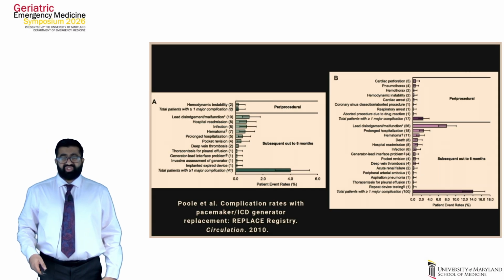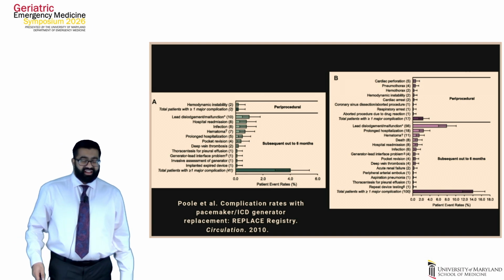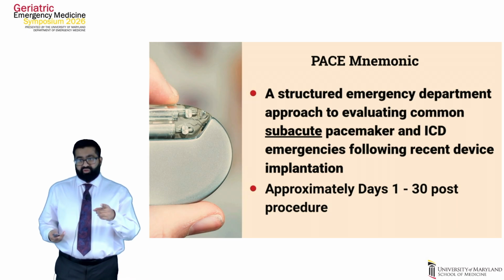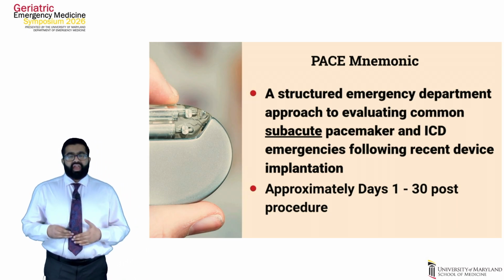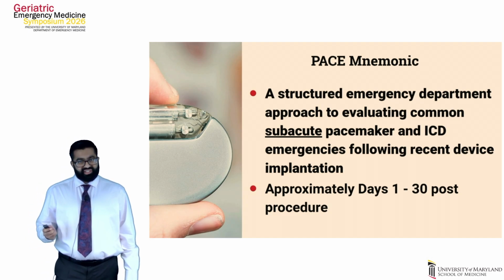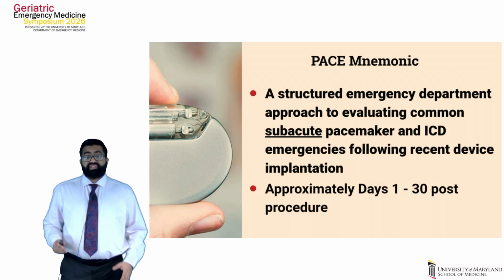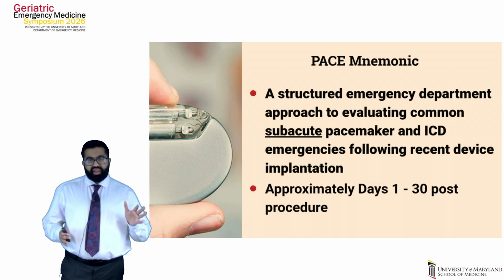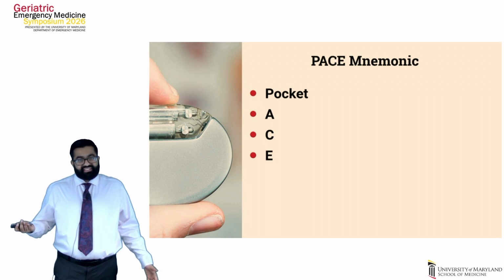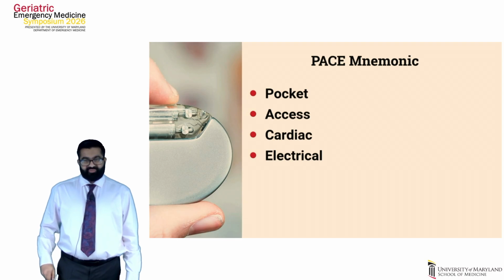Well, with pacers, there's so many things. Pneumothorax, bleeding, infection, electrical issues. The purpose of this talk is to provide you a structured emergency department approach to evaluate common subacute PACER and ICD emergencies following a recent device implantation. Subacute meaning approximately days 1 through 30. And I have a mnemonic for you. It's called PACE: pocket, access, cardiac, and electrical.